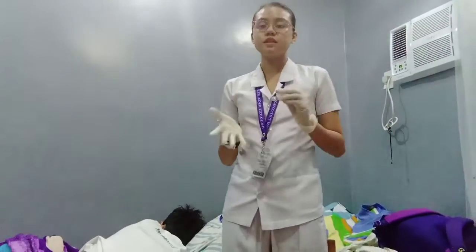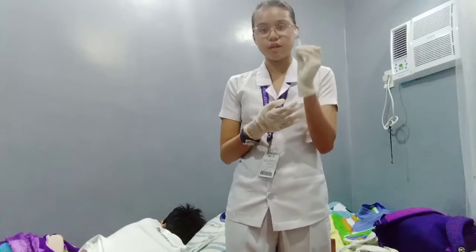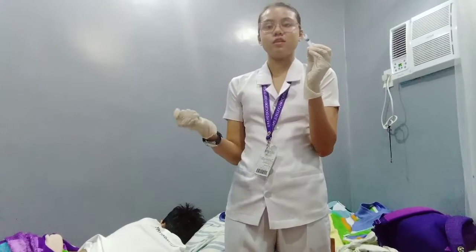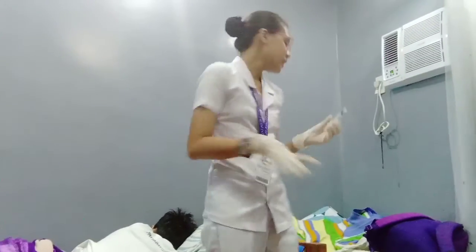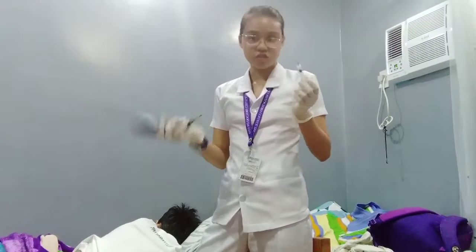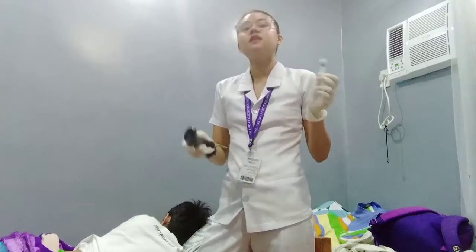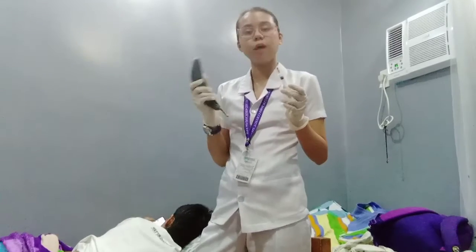Afterwards, we need to remove the needle cap by pulling it straight off the syringe with the thumb and forefinger of the dominant hand, to prevent the needle from touching the side of the cap and prevent contamination. Okay? Afterwards, we need to place the ulnar side of your non-dominant hand just below the injection site and hold the patient's skin taut laterally about 1 to 1.5 inches and hold the position until you've inserted the needle. If the patient has little muscle mass, grasp the body of the muscle between your thumb and forefinger.